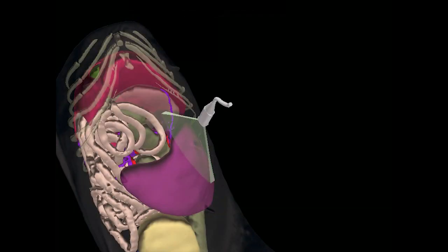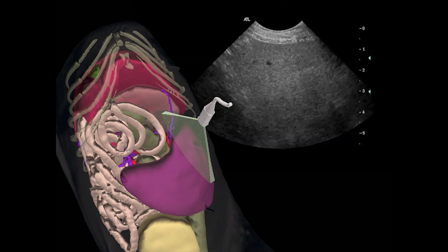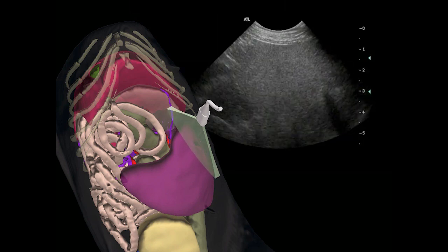A convex probe allows a larger section of the spleen to be scanned and may be more convenient when comparing it with adjacent structures for its echogenicity and echotexture. The examination starts with the head of the spleen, located caudal to the gastric fundus and medial to the ribs.